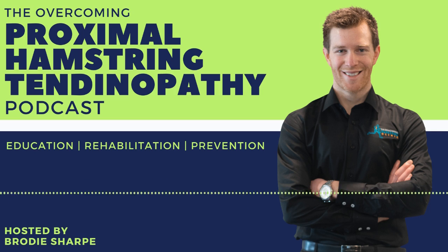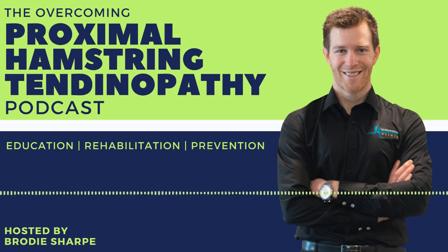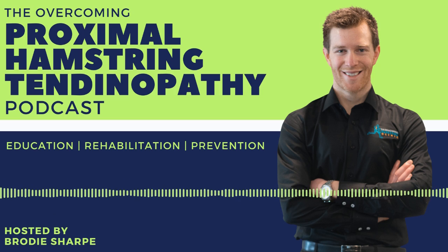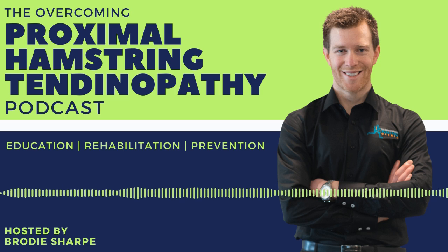So that's really important. So the first thing is desensitize the region, not to put direct pressure. And a lot of times they go on the internet and start stretching the hamstring, and that just irritates things. So when you're having shockwave, there's no point in doing your hamstring stretches or putting a foam roller right onto the bone. We don't want that. We just want to desensitize the region.